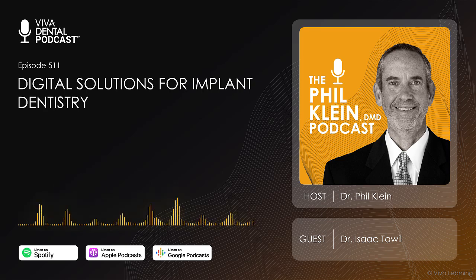Let me just ask you this, Dr. Tawil. Using 3D printers for crowns, where are we with strength? Is it as strong as, let's say, zirconia? No, it's not. We're not at that level yet, but it is coming.